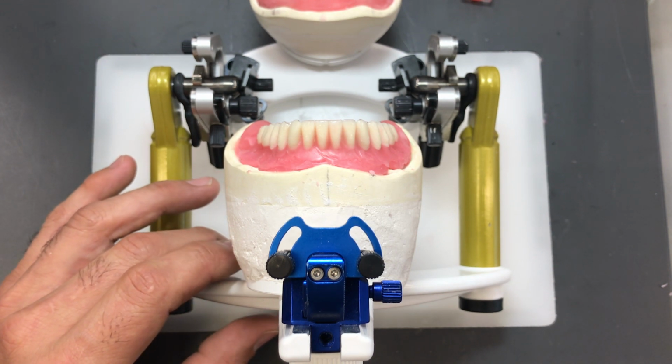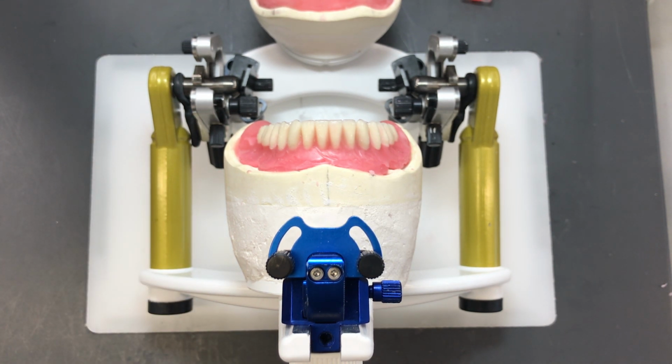Same level. Nothing really sticks above the plane of occlusion, so to speak. The buccal and lingual cusps of posterior teeth are leveled, parallel to the hinge axis of the articulator if mounted properly, and they're also level to the plane of occlusion.